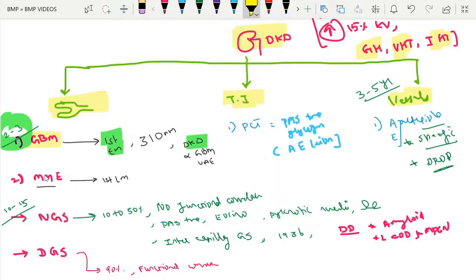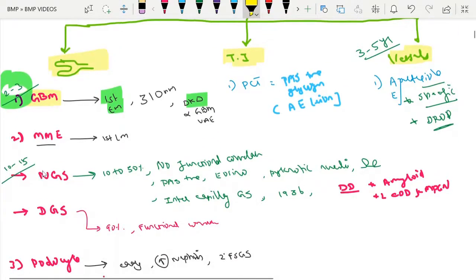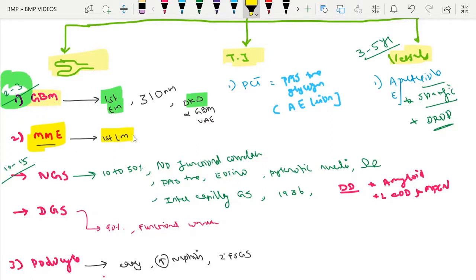The next important finding is mesangial matrix expansion. This is the first and important finding observed on light microscopy — the mesangial matrix is expanded and cellularity may reduce. This expansion can be described as either nodular glomerulosclerosis or diffuse glomerulosclerosis.